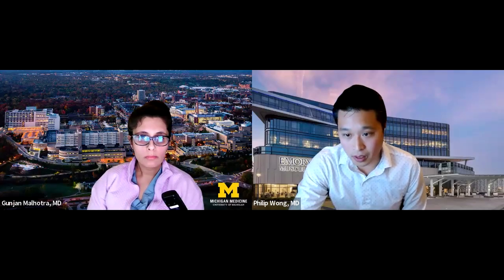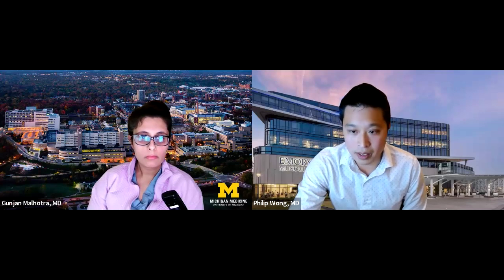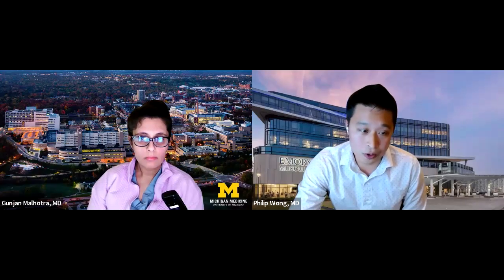So I do find it helpful. Then they'll end up getting a CT myelogram or MR of the cervical spine, if they don't have hardware in that region, to look for the preganglionic nerve root injury. But I will try to image the plexus as best as I can for those patients, which is more and more frequent.